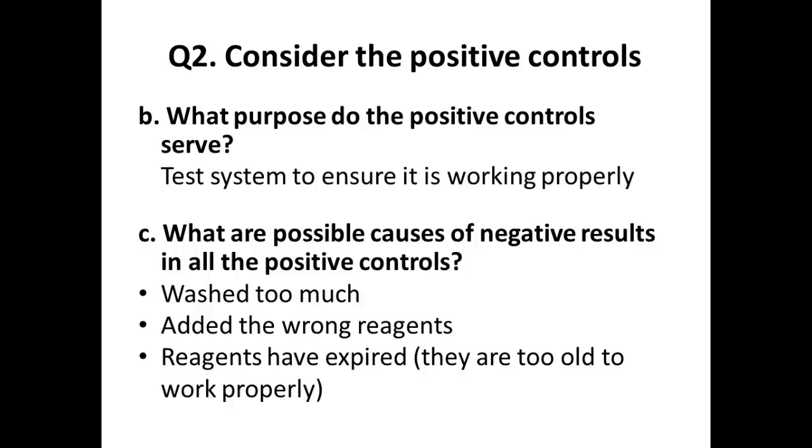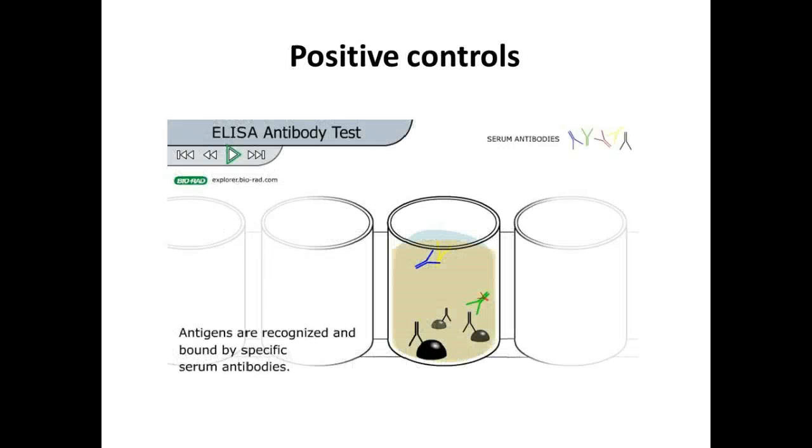They only have a certain activity level. And again, if you're running a pregnancy test and you don't get a positive control, then it's not valid.